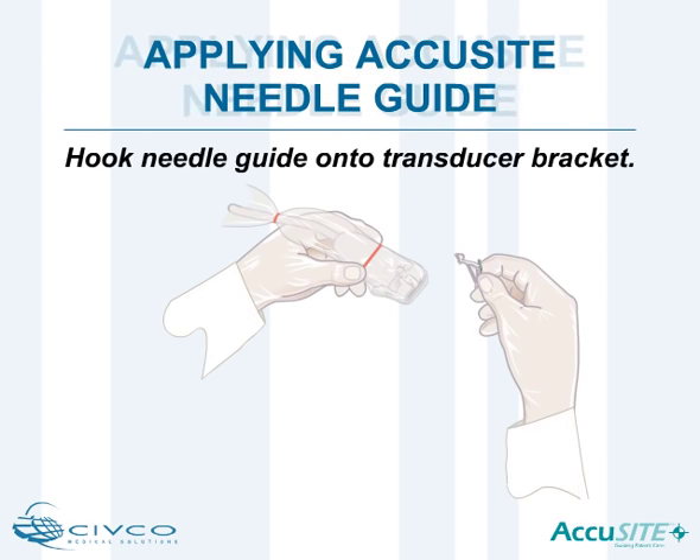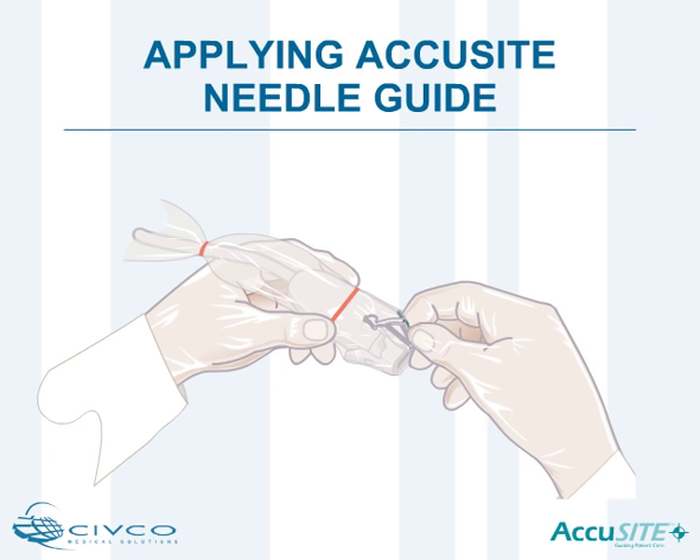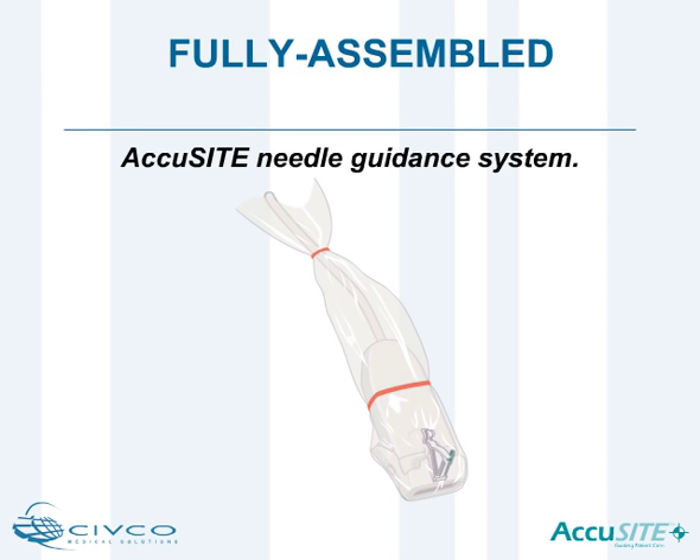Hook the needle guide onto the transducer bracket and snap it onto the attachment area with a single click. Ensure the colored tab is in the closed position. Once the needle guide is secured to the bracket and the colored tab is closed, the AccuSight needle guidance system is ready for use.